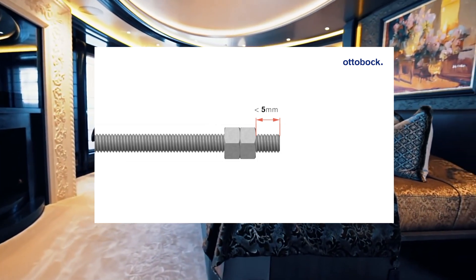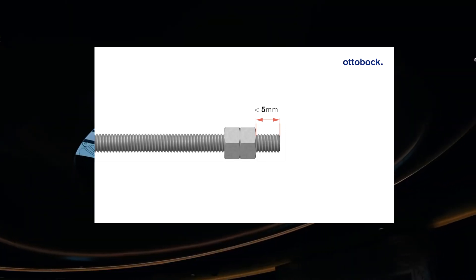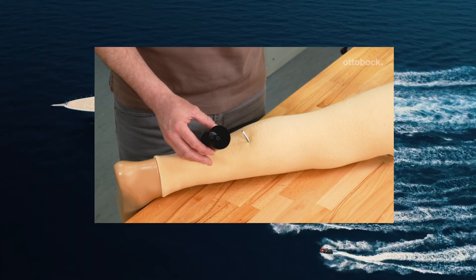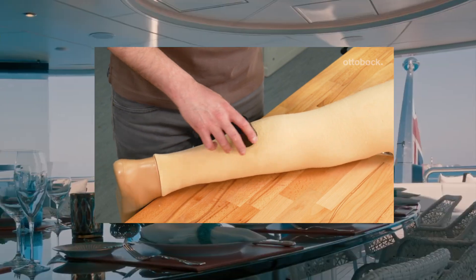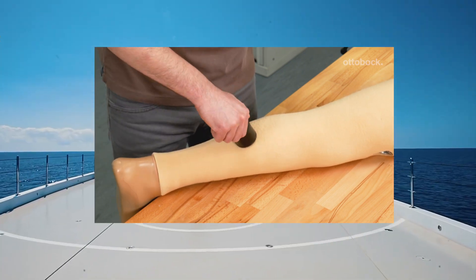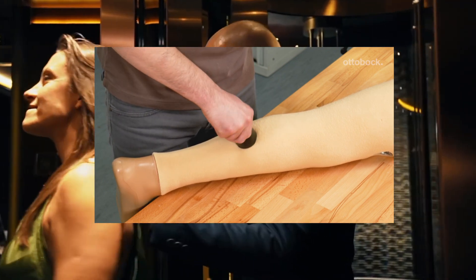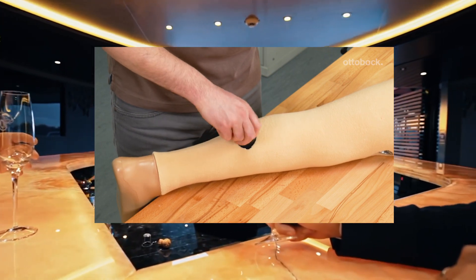If the nuts are loose, please fix them at a distance of 5 mm from the end of the centering rod. Apply the hole cutter to the centering rod and rotate clockwise to cut a hole into the foam cover. Please note: applying too much pressure can rip the foam and lead to an uneven inner surface. Remove the hole cutter by unscrewing the centering rod.